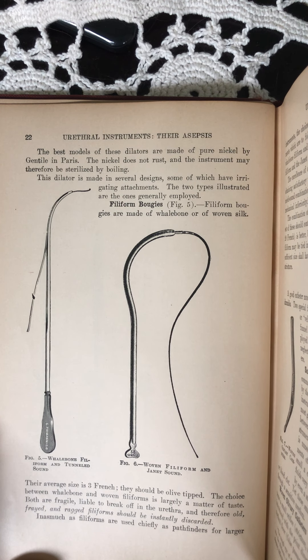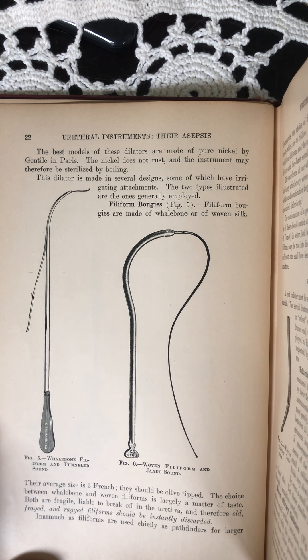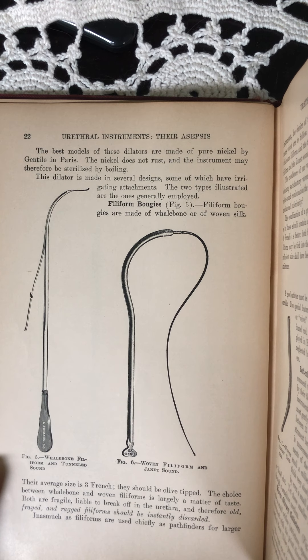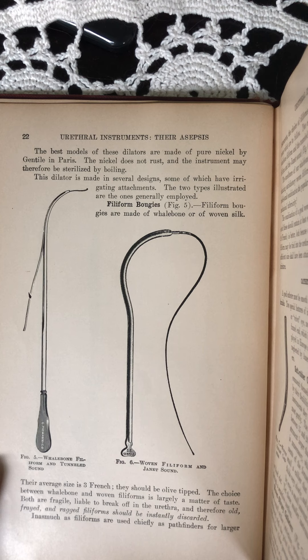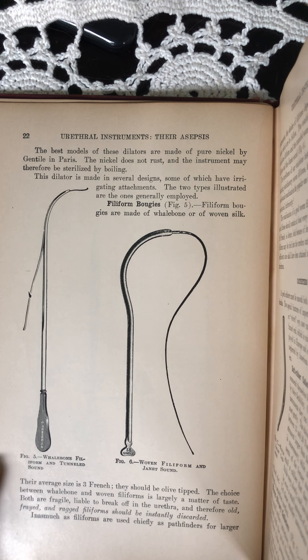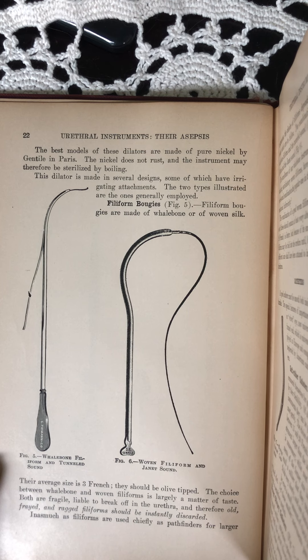Filiform bougies. Filiform bougies are made of whalebone or of woven silk. Their average size is 3 French. They should be olive tipped.